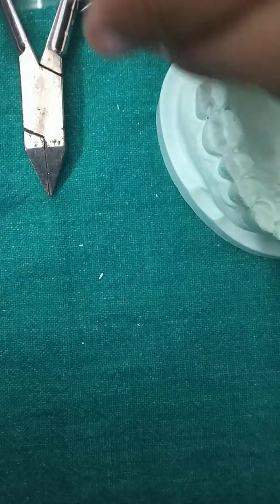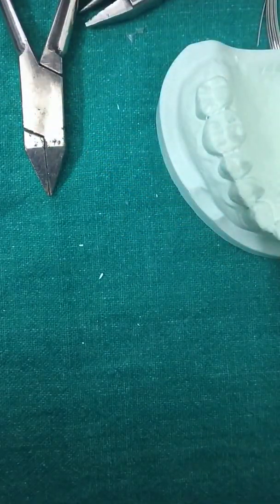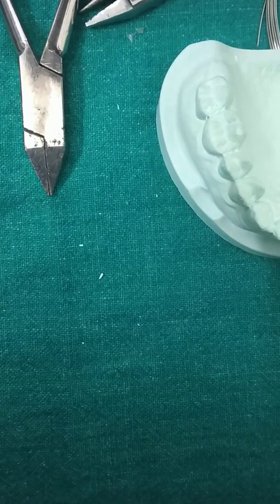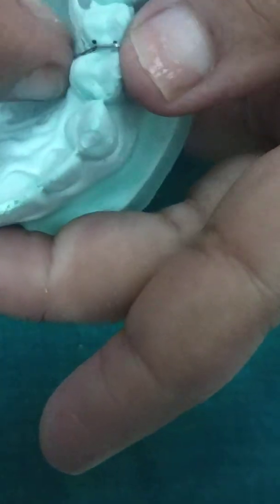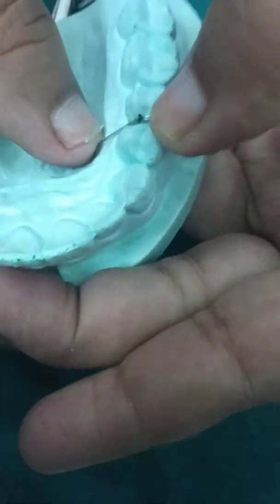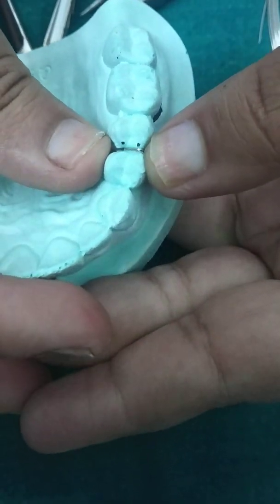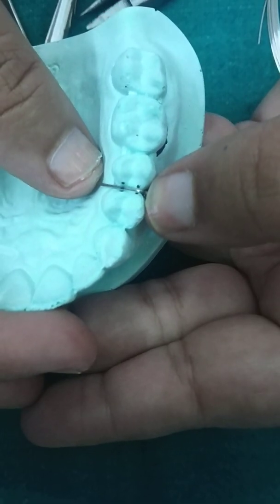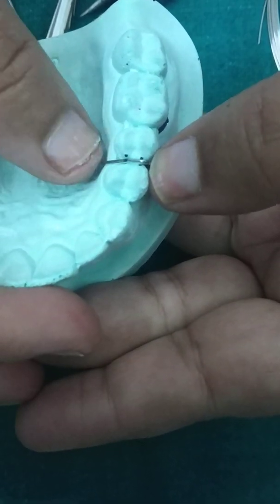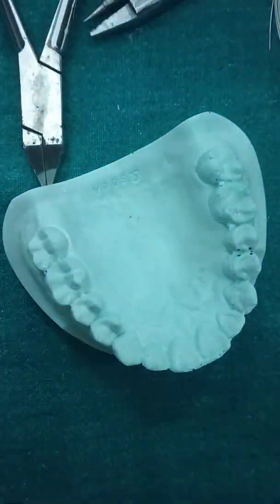Cut off any excess wire. Then place and check, and make the tag at the end region. Cut off any remaining excess wire.